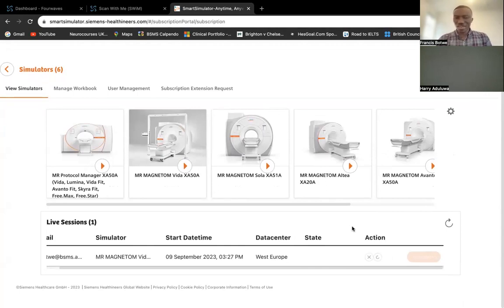It takes between 5 to 7 minutes, or it can be earlier, depends. You can see that the connect button here is grayed out, so you cannot click on it. You wait for some time for it to be activated before you can connect.